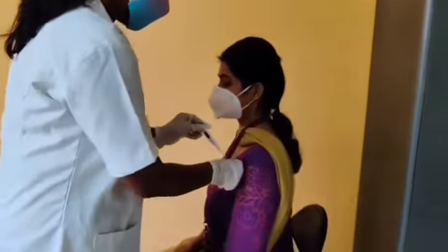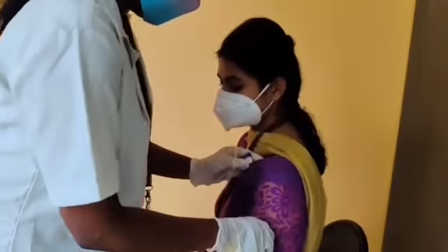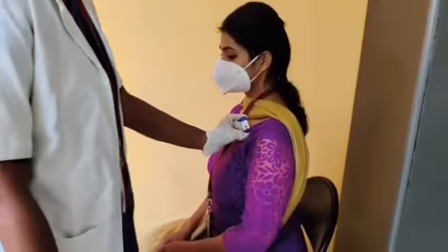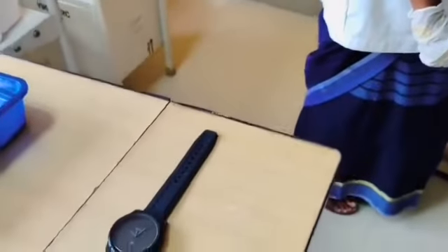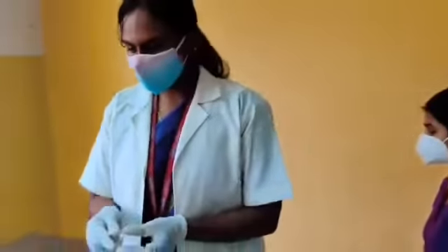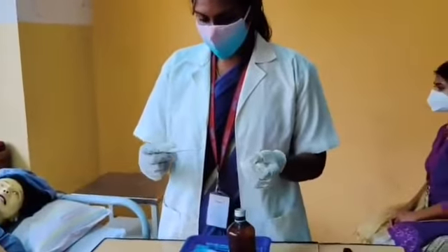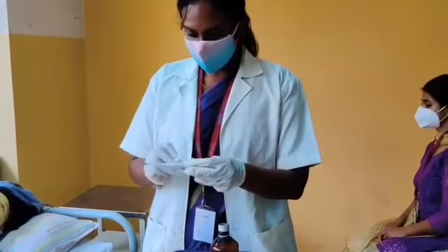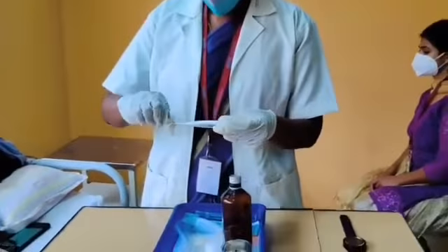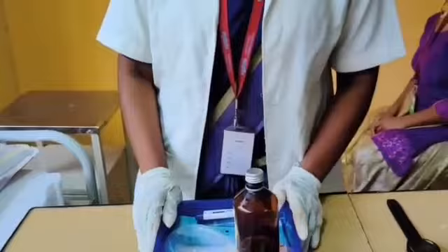After describing the procedure to the patient, we will keep the thermometer on the patient's axilla. After the beeping sound, we will take the thermometer out and check the temperature. For cleaning, wipe with spirit-soaked cotton from the stem to the bulb, discard the cotton, and replace the article.